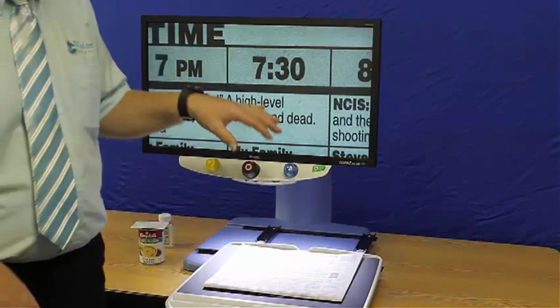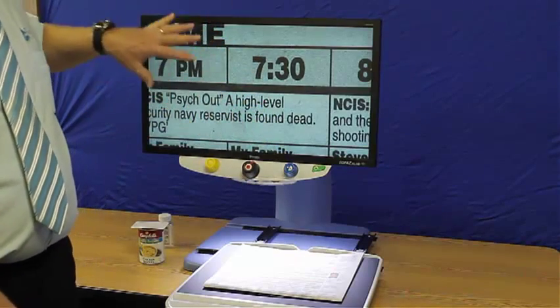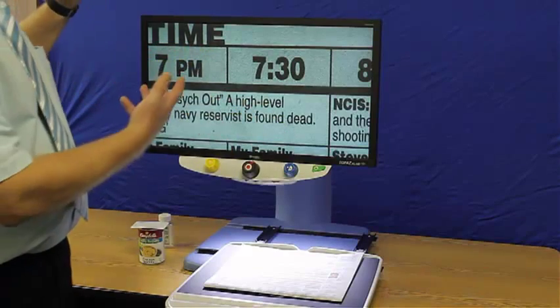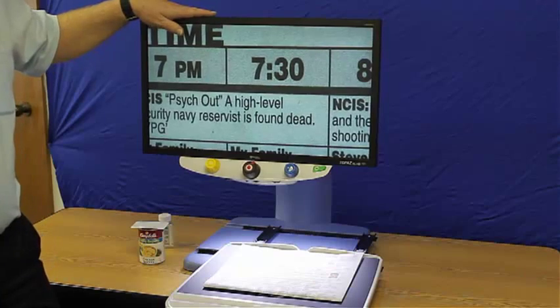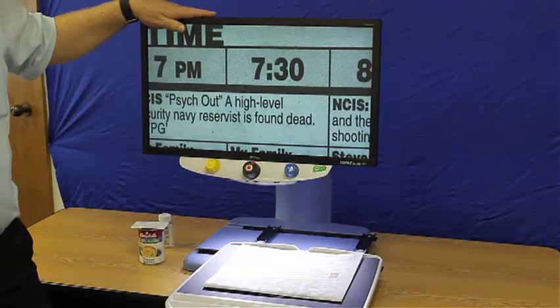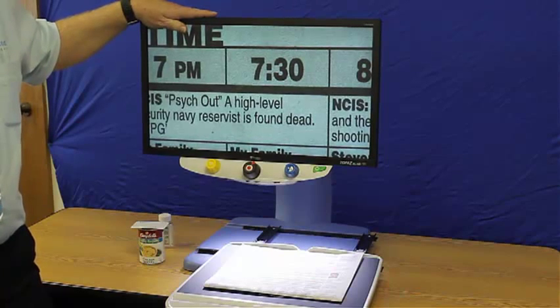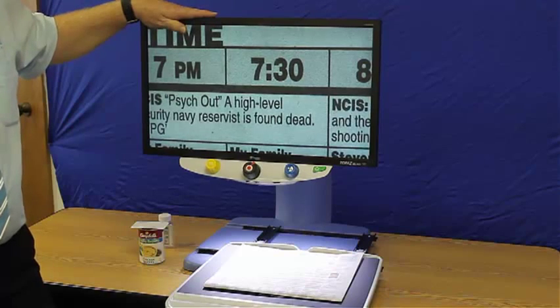When it's connected to a computer, pressing that makes this the computer screen. Pressing it again makes it the Topaz screen. People ask, well, does it magnify the computer screen? No, this will not magnify the computer screen. To do that, we have to install a special program onto your computer, which we can visit with you about later.